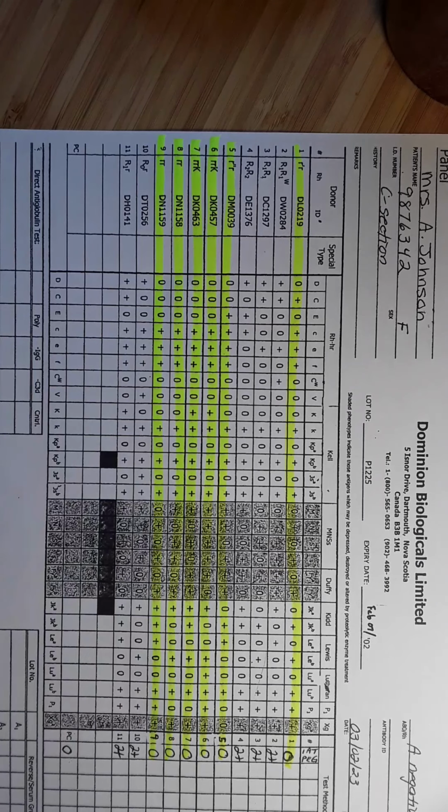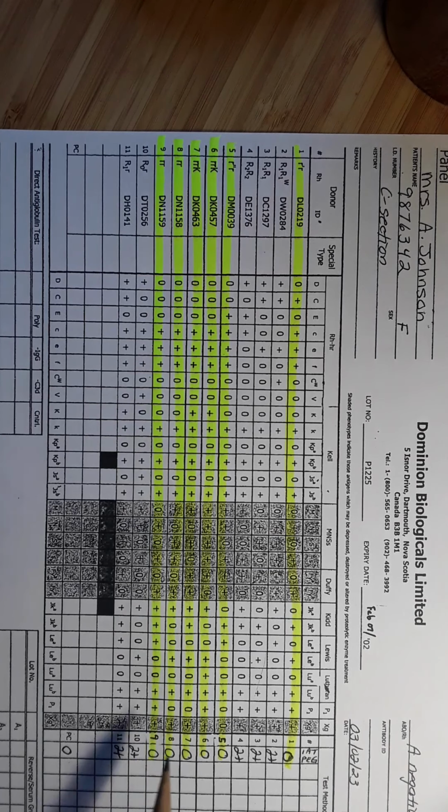So the reason I'm highlighting negative rows is because we are going to start excluding, as in saying that that antibody is not present based on non-reactivity of the patient's plasma with the antigens on the cells. So we're going to get started working on that.